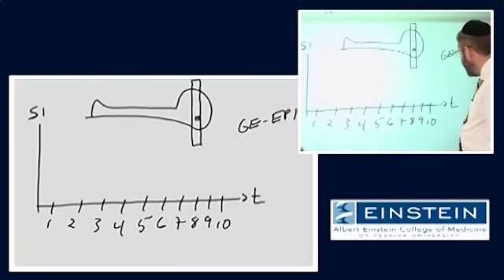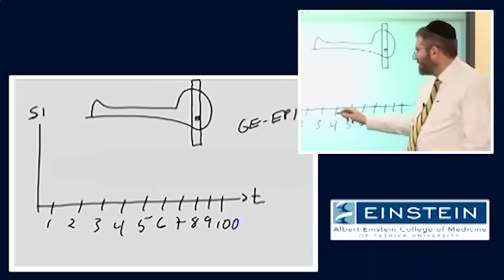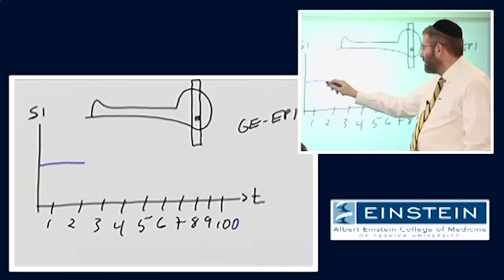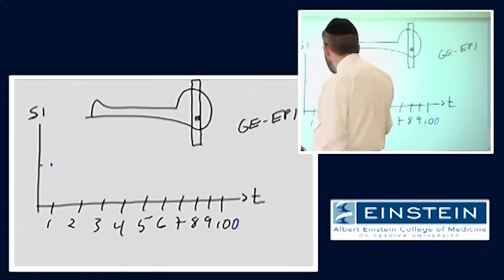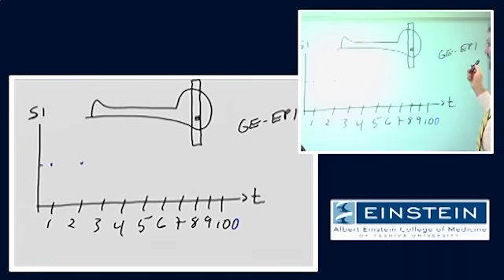But let's say we're going for 100 seconds or whatever it is. So at the outset, we would have some baseline signal amplitude which is just the gradient echo echoplanar signal from that tissue.